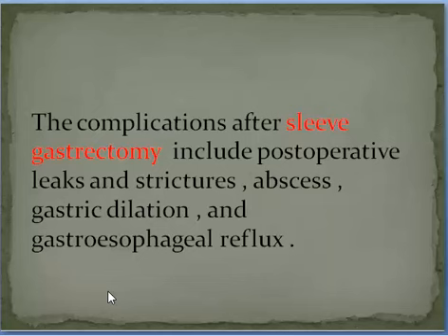The complications after sleeve include postoperative leakage, strictures, abscess formation, gastric dilatation, and gastroesophageal reflux. Please don't forget that the most important here is leakage, which will result in abscess and associated gastroesophageal reflux.